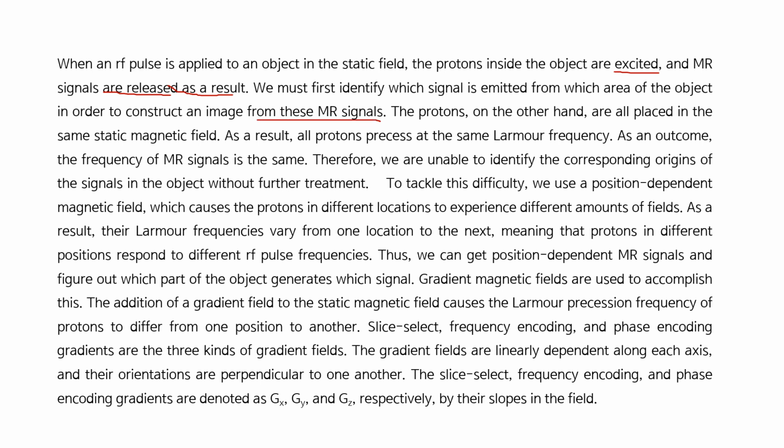The protons, on the other hand, are all placed in the same static magnetic field. As a result, all protons precess at the same Larmor frequency. As an outcome, the frequency of MR signals is the same. Therefore, we are unable to identify the corresponding origins of the signals in the object without further treatment.